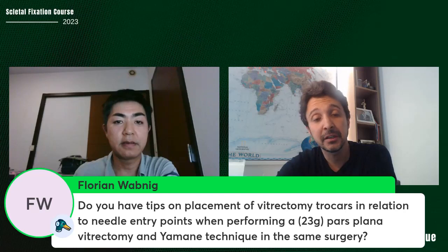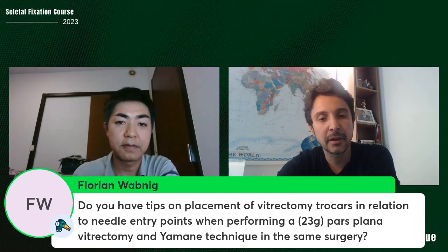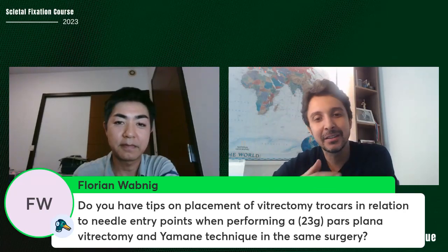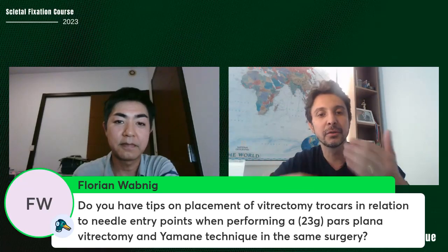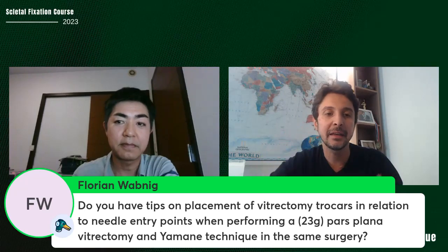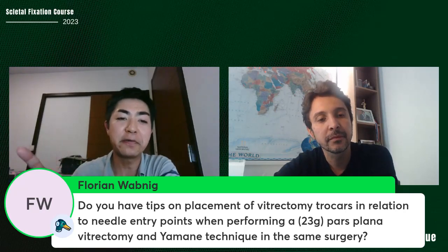Yeah, Shin, I like this important point. I always discuss it with my colleagues and fellows. You need to use the same point every time. If you change the position, it is not good for your technique, for any technique, because you need to repeat the same position. This is better for improving your technique in any, in Yamane, in Glued IOL, in my technique, in Gabor. I like it. I think it's an important tip too. If you change one, you must change everything.